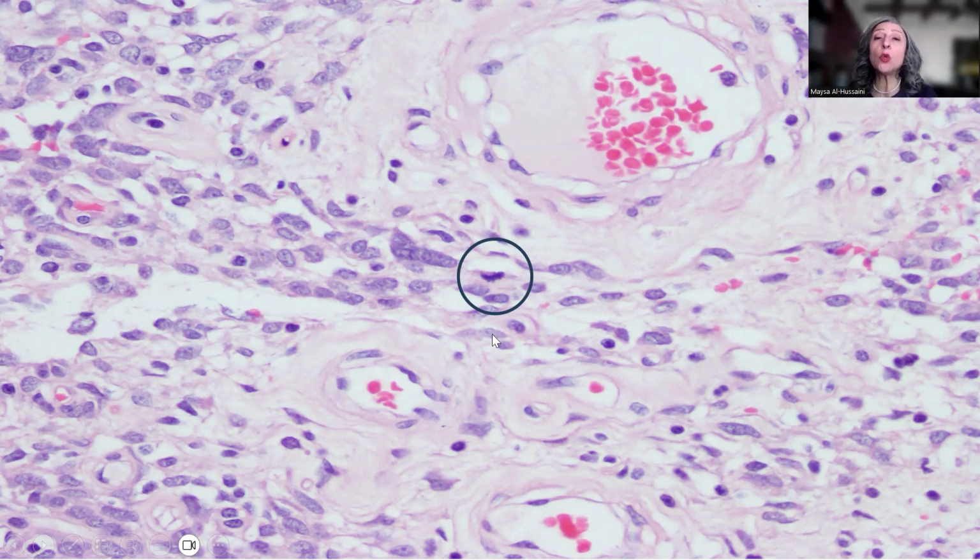Another important clue to the diagnosis is the presence of hyalinization of the tumor vessels. And remember, hyalinization would mean in general that the tumor is long-standing. It has low malignant potential, let's say. And again, more of the same appearance of the tumor cell nuclei here. These are spindly, sometimes they are oval, slightly stellate cell nuclei, but in general, they retain the same morphologic appearance for the chromatin, as well as the lack of atypia and hyperchromasia.